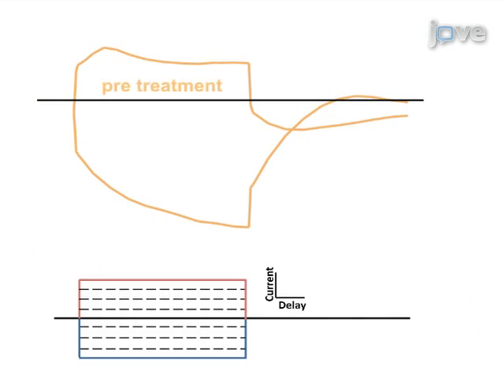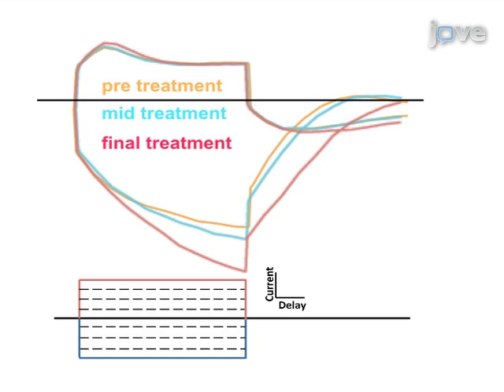Multiple nerve excitability parameters are recorded in response to different stimulus patterns, which assess markers of peripheral ion channel function and membrane potential in order to evaluate nerve function. Results are obtained that show the longitudinal changes in sensory axonal excitability with chemotherapy treatment and provide a method to detect these changes earlier than conventional techniques.